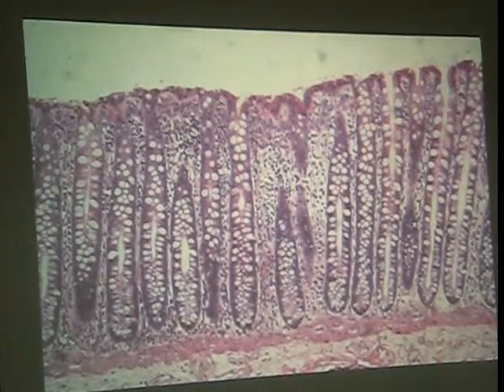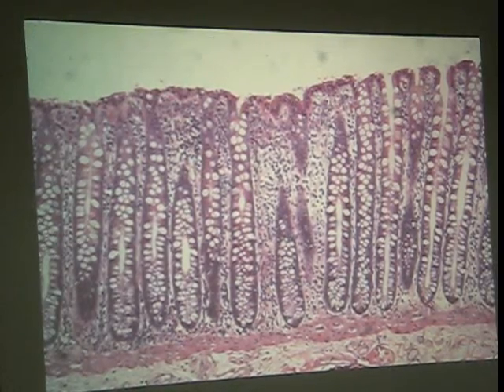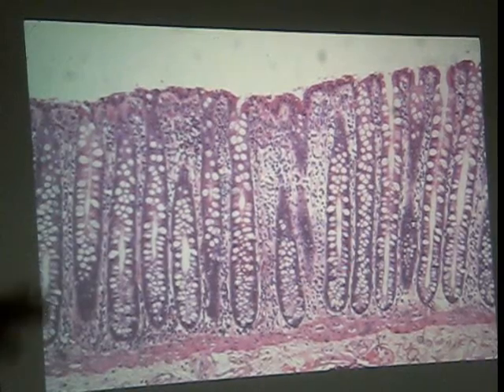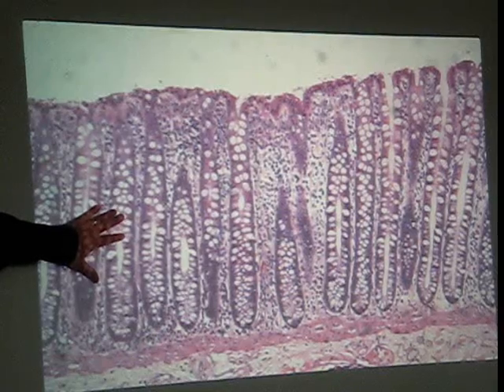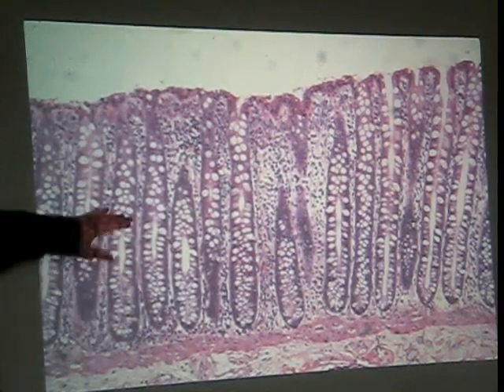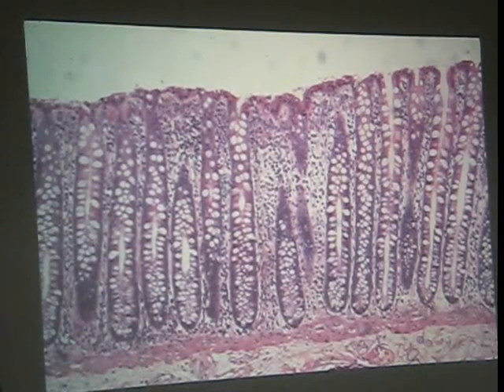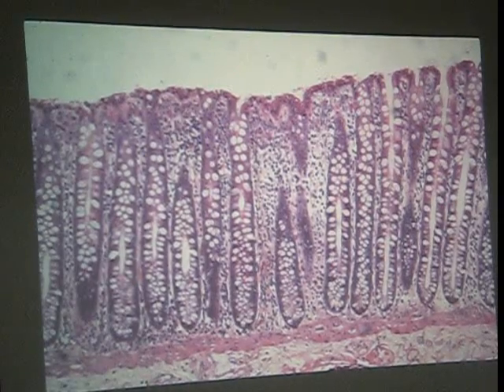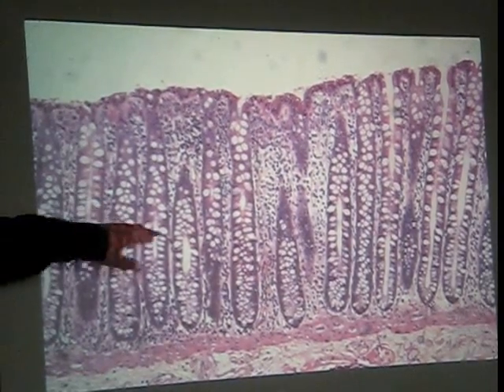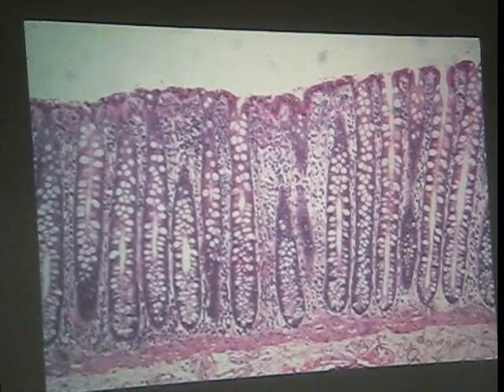All right. Where are we? Large intestine. Okay, clearly large intestine. So imagine just cutting the villi off, leaving behind intestinal glands, kicking up the number of goblet cells, the relative number. You don't have a lot of absorption. You're not absorbing most of the nutrients, the carbohydrates, proteins and fats, all taken care of in the small intestine. Here it's mostly water, and you got to produce a lot of mucus to lubricate the fecal mass as it moves down the tract.